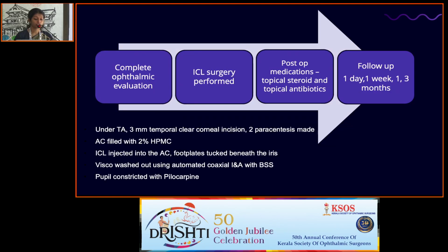January 2023. All patients underwent a complete ophthalmic evaluation, and the ICL surgery was performed by a single surgeon under topical anesthesia, with a 3 mm temporal clear corneal incision and 2 paracenteses made. The AC was filled with 2% HPMC, the ICL injected into the AC, footplates tucked beneath the iris, and the visco washed out using automated coaxial irrigation and aspiration with BSS solution, and the pupil constricted with pilocarpine.